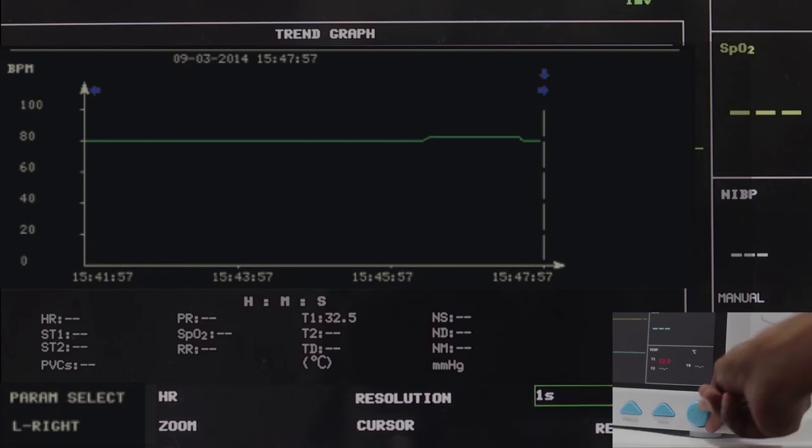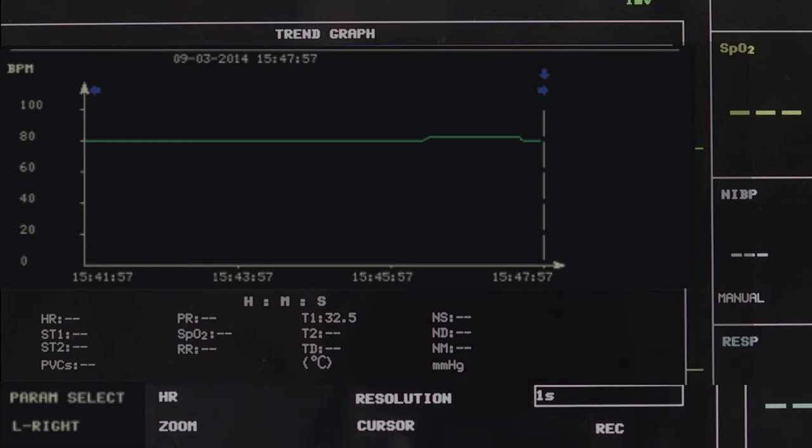To select 1 hour or 480 hour trend graph, pick resolution item. To view other trend curves, pick left to right item. Right side shows later trend curves. Left side shows earlier trend curves. To change the display scale, pick the zoom button. To print out the trend curve, press record button.